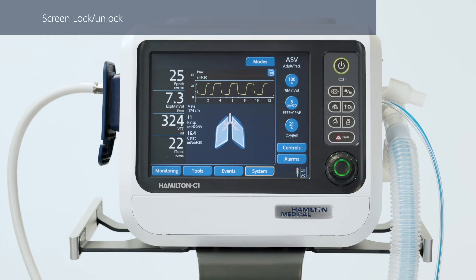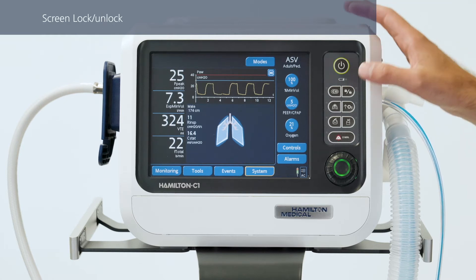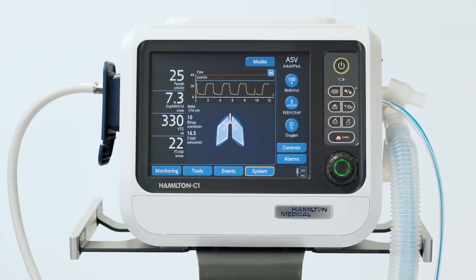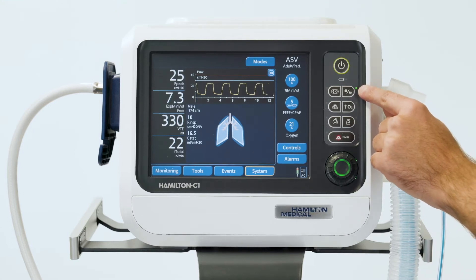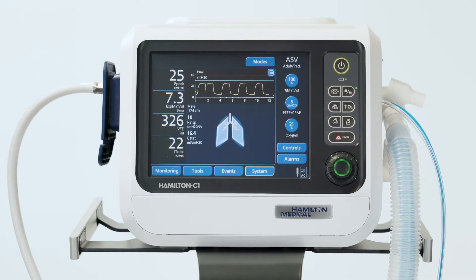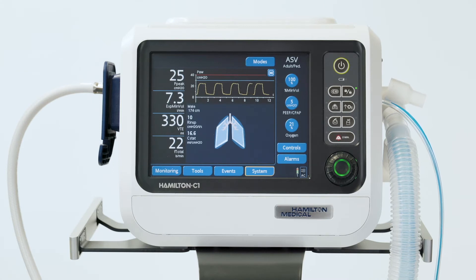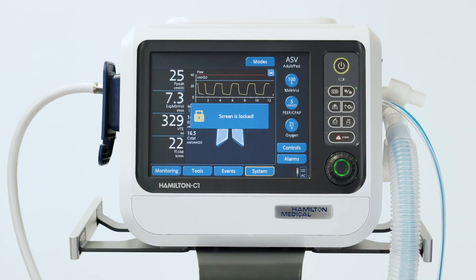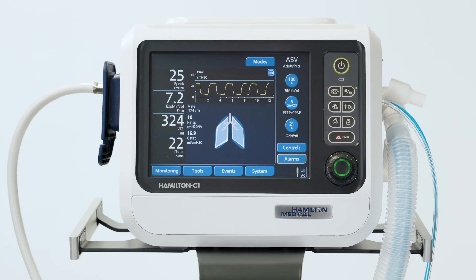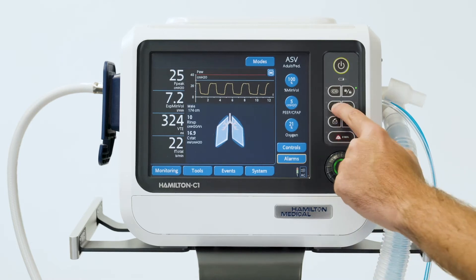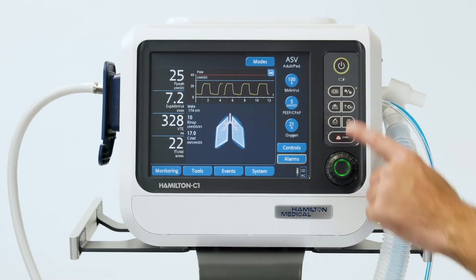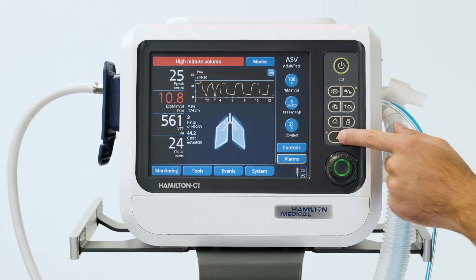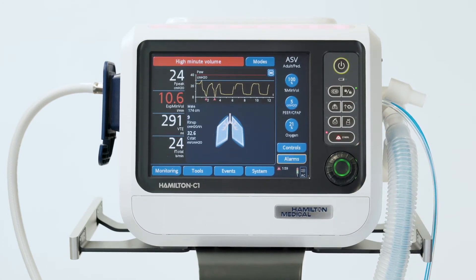To prevent information from being entered accidentally, you can lock the touch screen. When the green indicator next to the key is lit, you know that the screen lock is active. If you touch the screen, this will generate an audible beep and a screen lock active message will be displayed. Even when screen lock is active, some device controls like the manual breath keys, oxygen enrichment, and alarm silence still remain available.